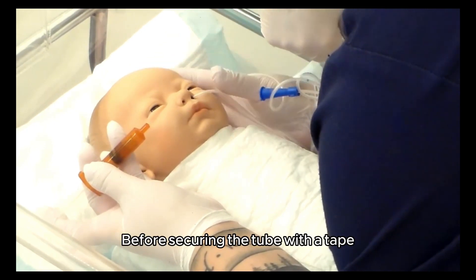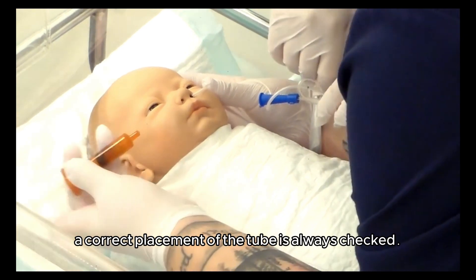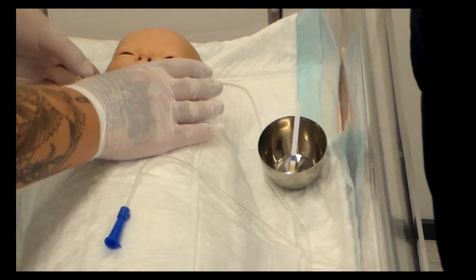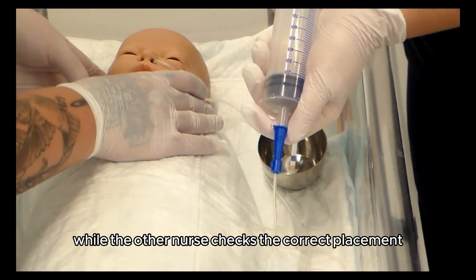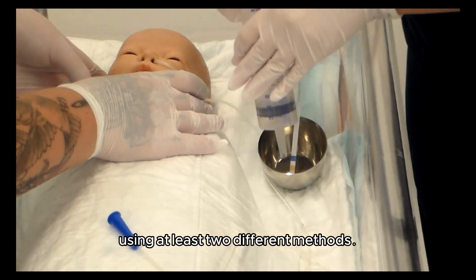Before securing the tube with tape, the correct placement of the tube is always checked. The assisting nurse holds the tube in its place while the other nurse checks the correct placement using at least two different methods.